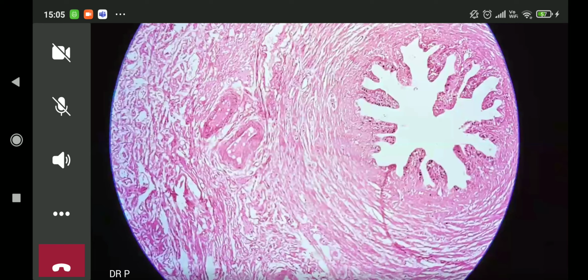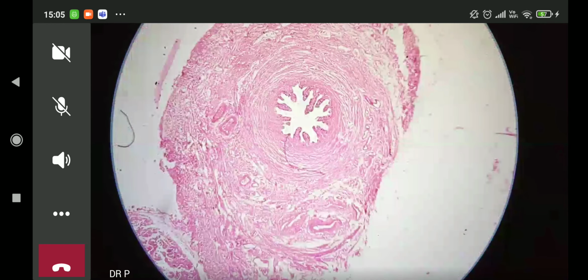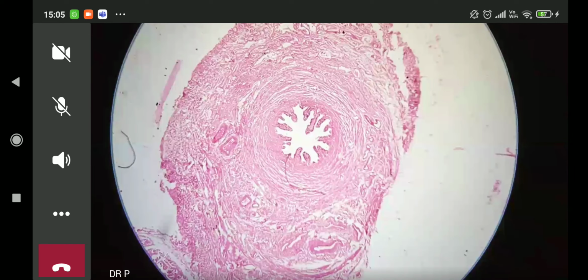let's come here. So in the exam, especially for the postgraduates, I often tell them this, and now that it's come in an undergraduate slide, I'll tell you this also. Be very careful. For undergraduates, we're a little lenient. So what we do is that we generally focus the pathology and give it to you on a plate. So we tell you not to shift the focus of the slide, because in exams, we want you to just see what we have focused for you so that you can make the diagnosis.